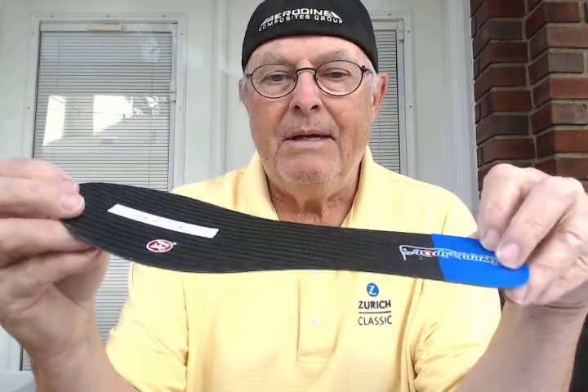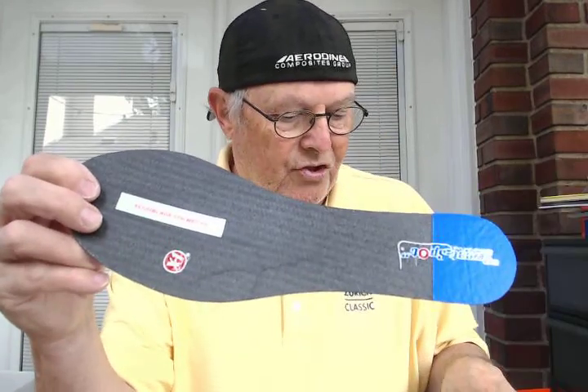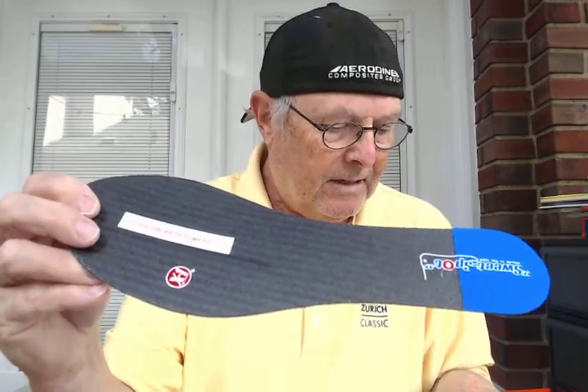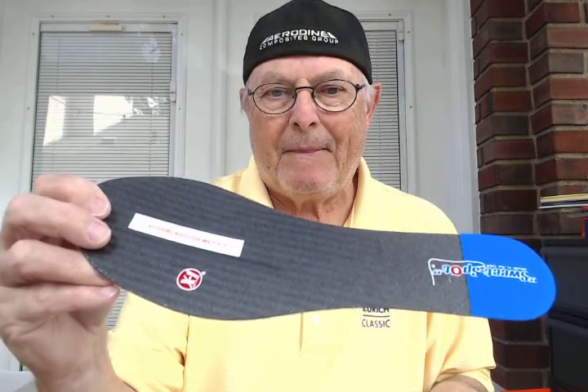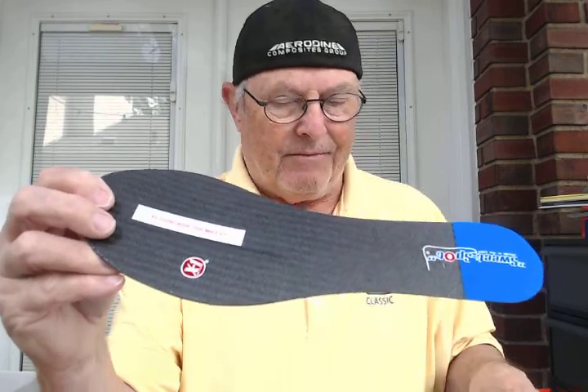It's an all-composite blade, so it's only a 25th of an inch thick, weighs less than an ounce, and Sean shouldn't even have a problem at all. This should solve his discomfort problem. He had surgery and had two screws placed at that site, and that's sometimes where they get a little discomfort.